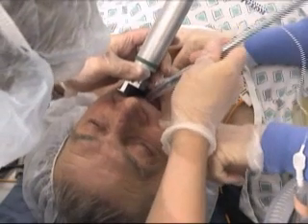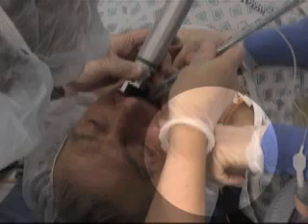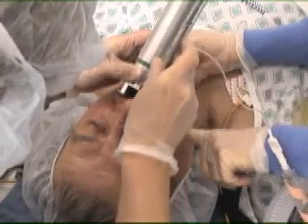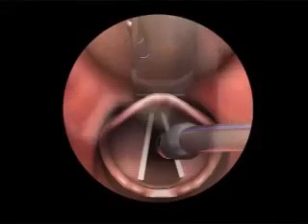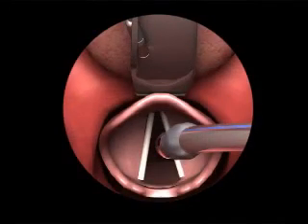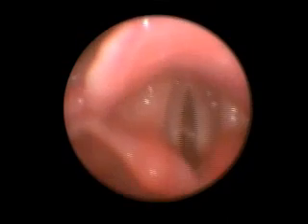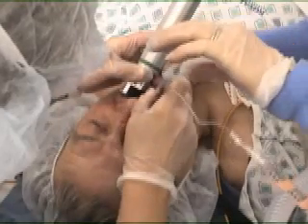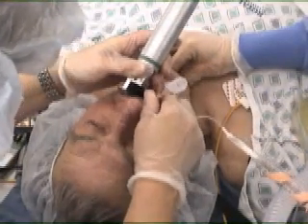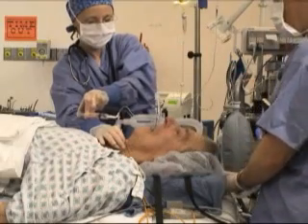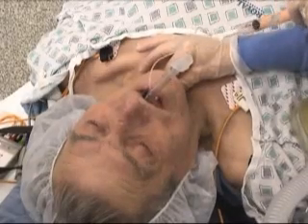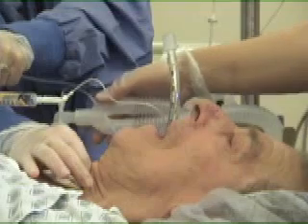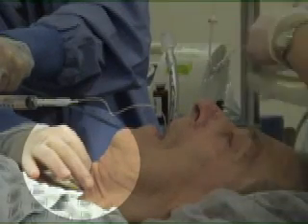If available, an assistant should gently pull on the right side of the cheek to enhance visibility of the glottis. Hold the endotracheal tube in your right hand. While maintaining your view of the vocal cords, insert the endotracheal tube into the right side of the patient's mouth. The tube should not obstruct your view of the vocal cords during this critical part of the procedure. Pass the tube through the vocal cords until the balloon disappears into the trachea. Remove the stylet and advance the tube until the balloon is 3-4 cm beyond the vocal cords. Inflate the endotracheal balloon with air to the minimum pressure required to prevent air leaks during tidal volume ventilation with a bag, usually requiring less than 10 cc's of air. The assistant must maintain cricoid pressure until tube placement in the trachea is confirmed.